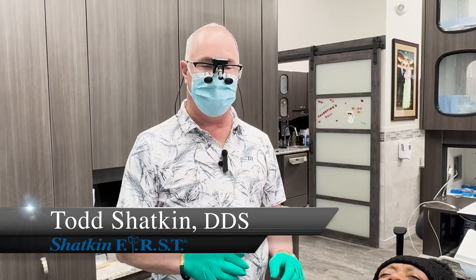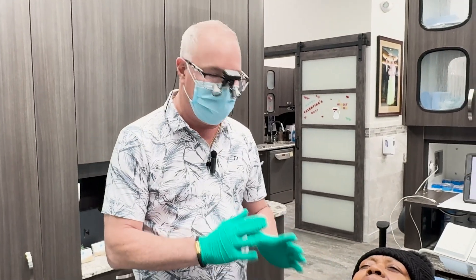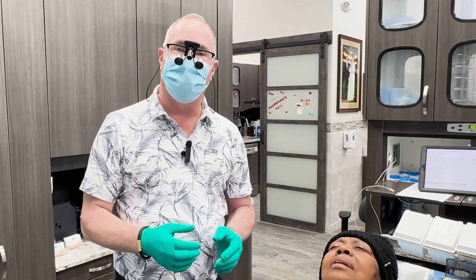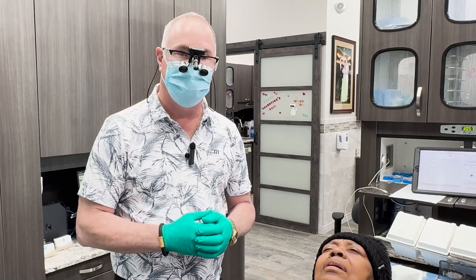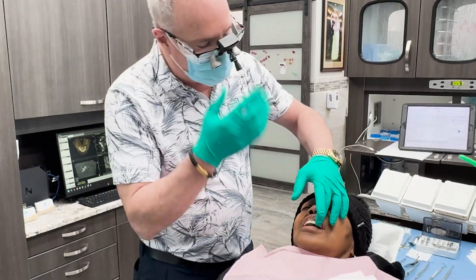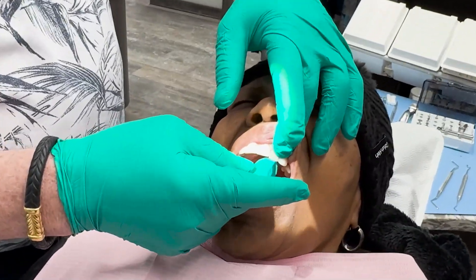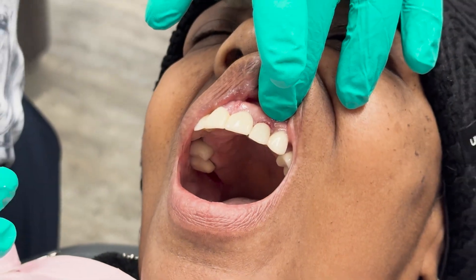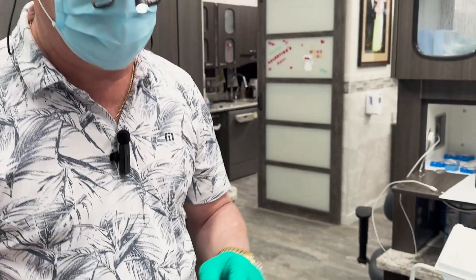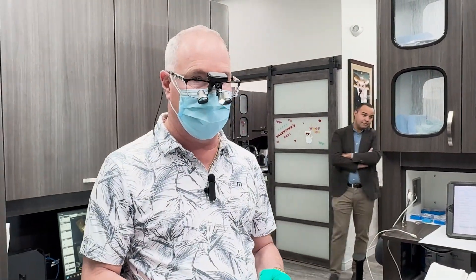Today we're going to be taking out tooth number 10 on this lovely lady, Marie, who's been a long-time patient of mine. We're going to be replacing it with a 3mm by 13 length mono implant. Tooth number 10 is mobile — it's an old tooth that had a root canal, post, and crown and it needs to come out. So we're going to be extracting that today and immediately placing a mono implant.